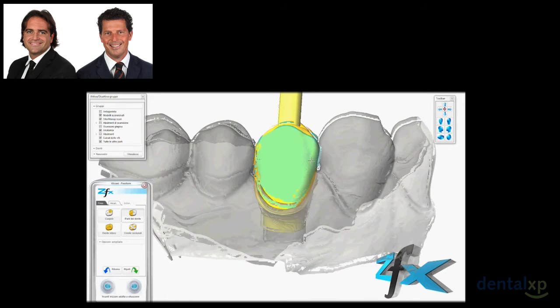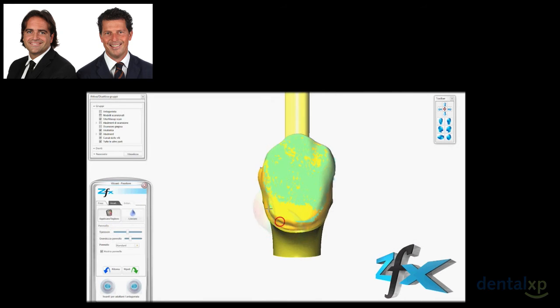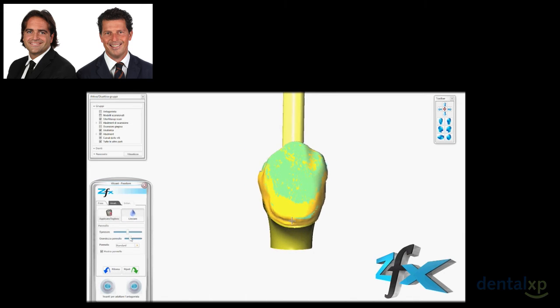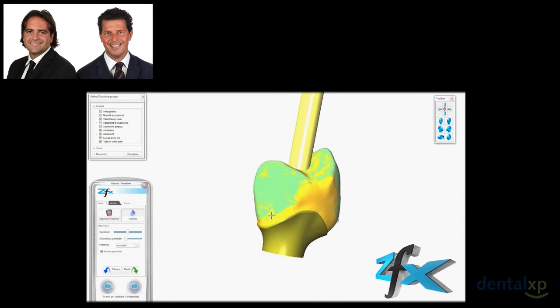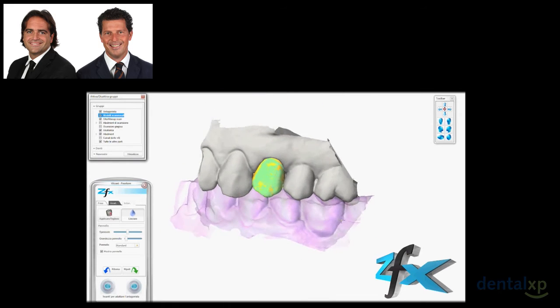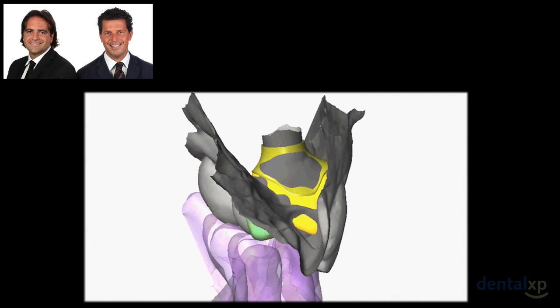And what he's doing here is just matching our temp to the temp of the library software. And that's why, once again, it's important to spend time in doing your temporary. You can see here he is matching it, and then he's placing it inside the software again, and you can see he has everything under control. Look at this screenshot.